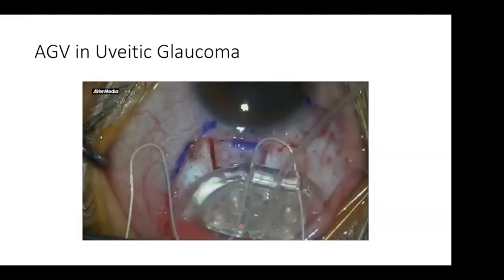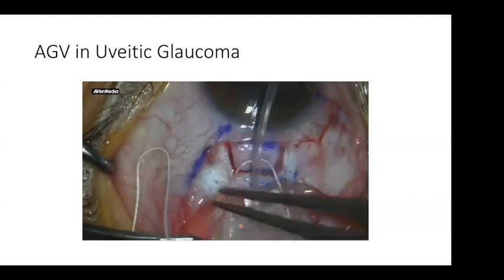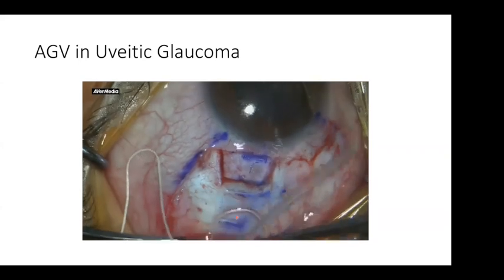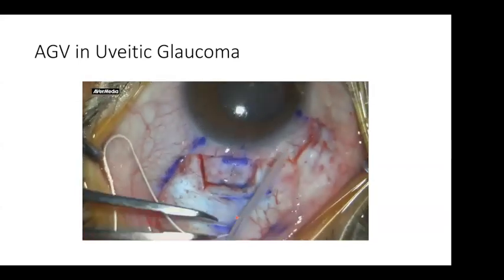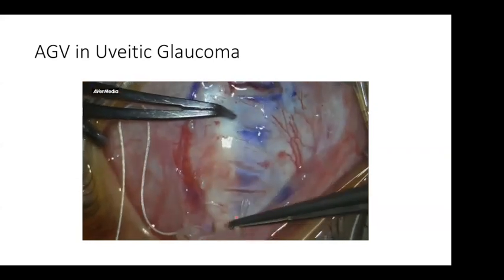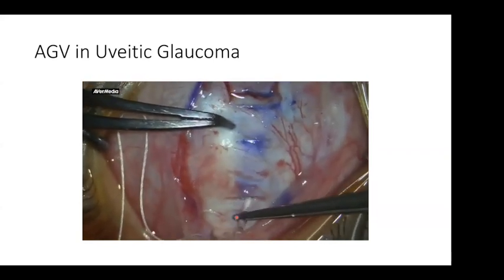Again, when you push it, it's very important that the implant slides smoothly. Once you push it back, it shouldn't jump all the time. Otherwise, there is a lot of resistance.